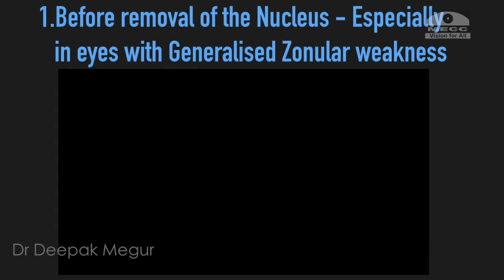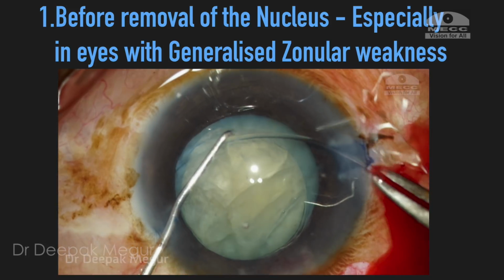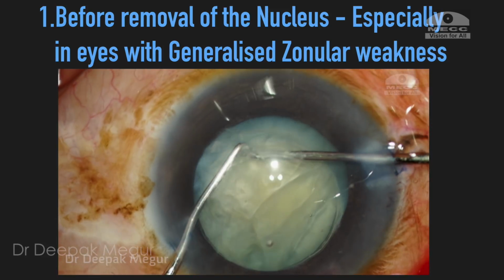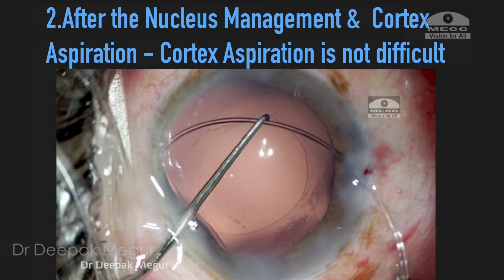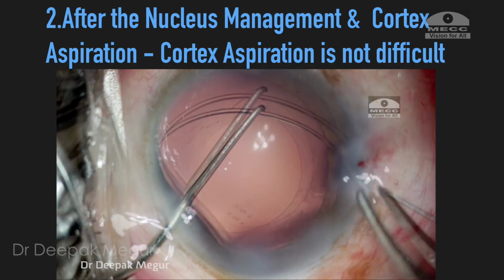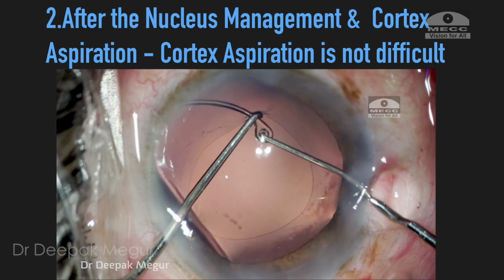The first option would be inserting the CTR before the nucleus removal, that is, just after completing the rhexis. The second option would be to do it at the end, that is, after the nucleus management and cortex removal and before the IOL implantation. Well, each of them has its pros and cons.